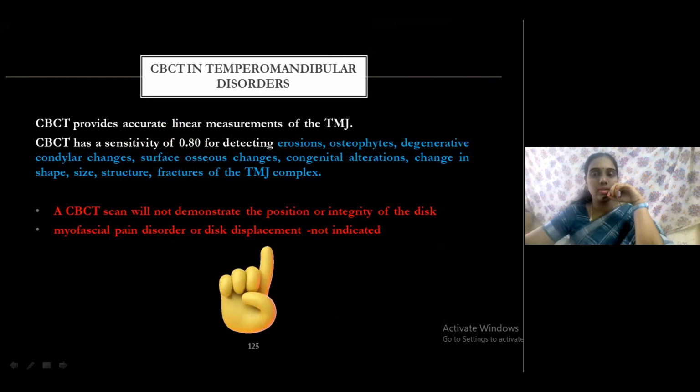Yes. Next, coming to CBCT in temporomandibular disorders, which is of great interest to me as an oral physician myself.